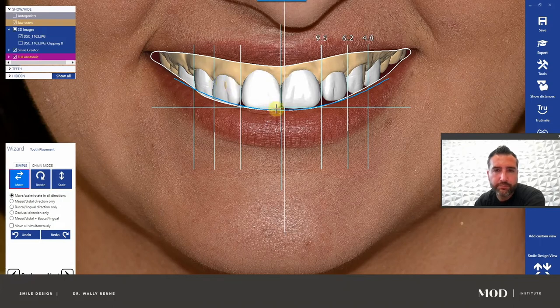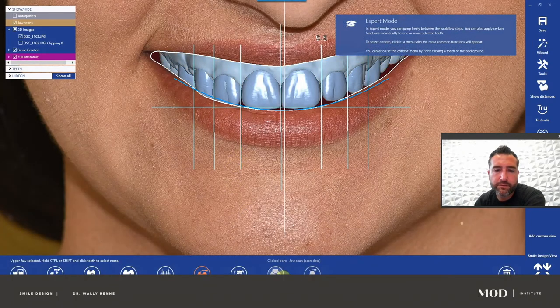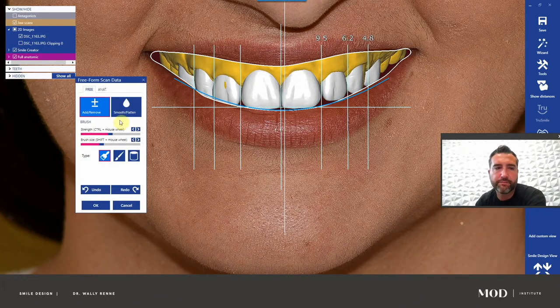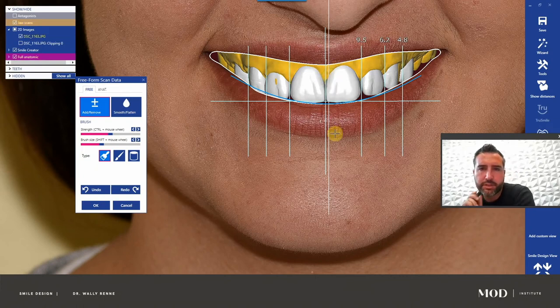I would also try to correct for some maxillary asymmetries here with some prosthodontics. So I'm going to go to expert mode, click on the model, go to freeform scan data, and edit the model from this smile design view — not rotated at all. I'm going to hold shift which switches from add to remove (green to red), and go ahead and lengthen the centrals right to about the upper lip here. We're probably talking about two millimeters tops of gingivectomy, maybe with a little bit of osseous removal.